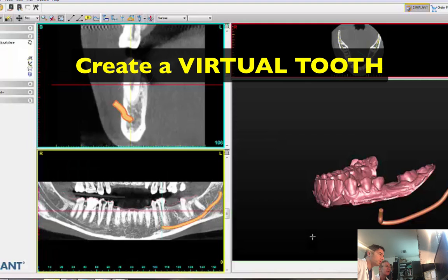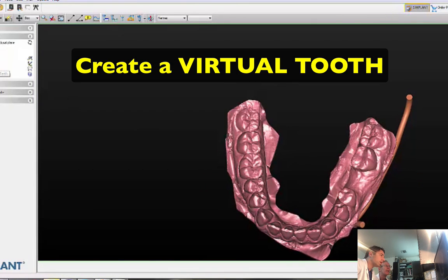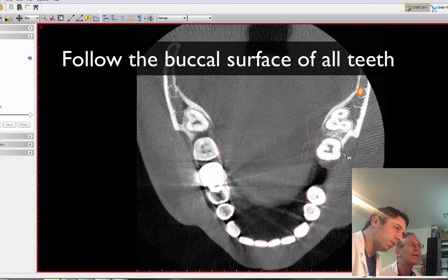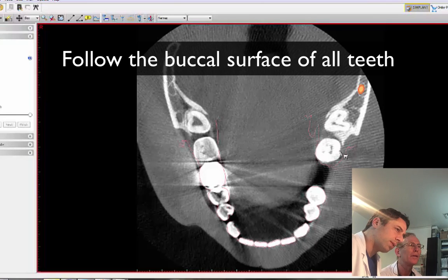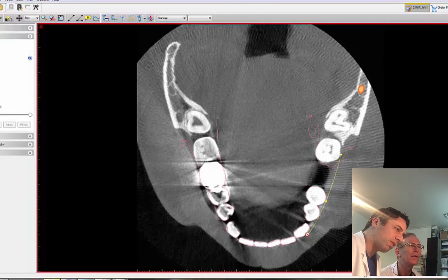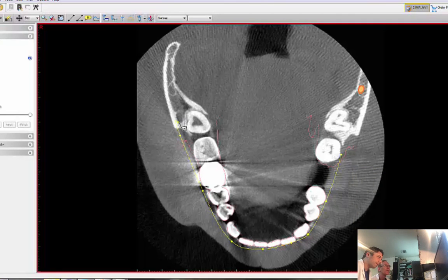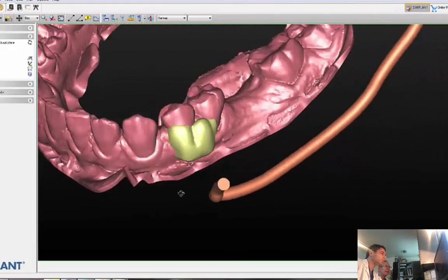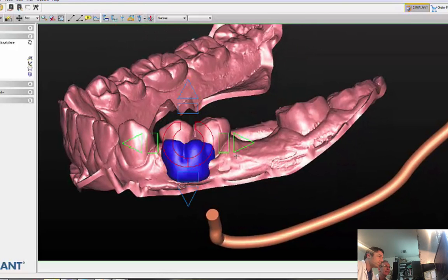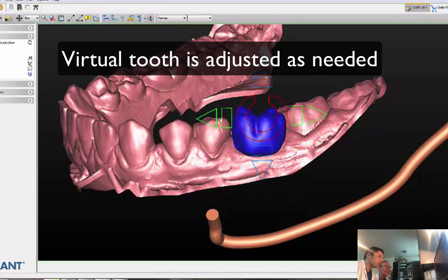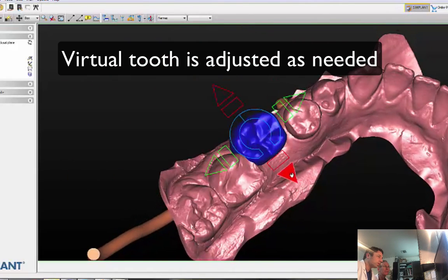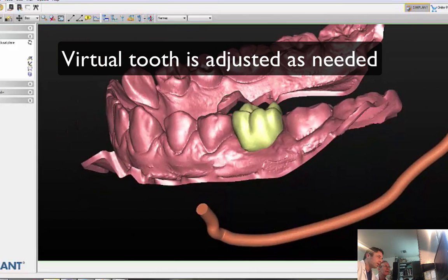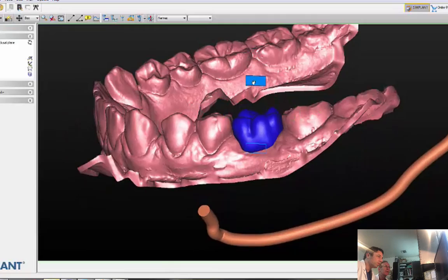The second thing that is important — next, virtual tooth. What they want you to do is give them the curvature on the buccal. I'm just going to go to the coronal part of the teeth and make a line roughly, then click next. Pick tooth number 19 — it's going to throw in a tooth and finish, placing it roughly in position. What I need to do is move it into position and rotate it. I can look at the occlusal. There's a little bit of a mesial drift, as you can tell. It's not perfect, but it gives you an idea of what the tooth is supposed to be.